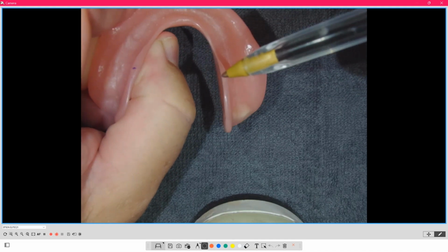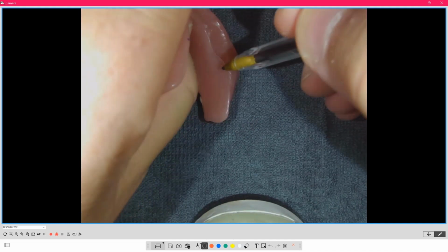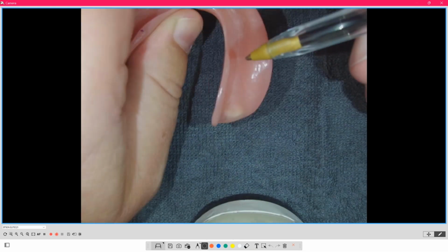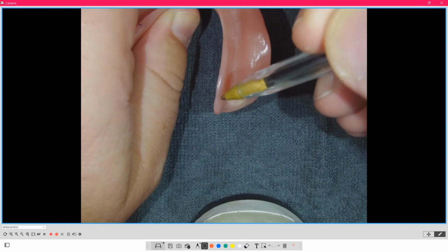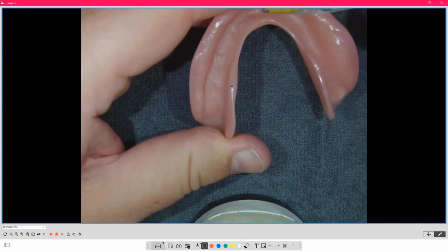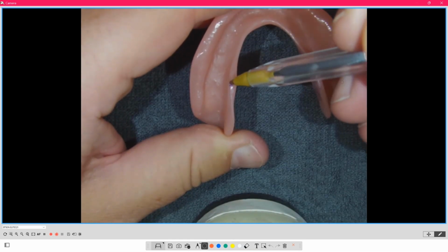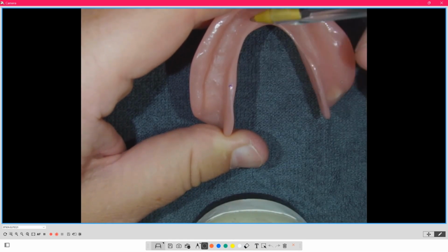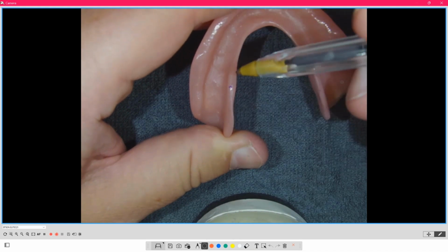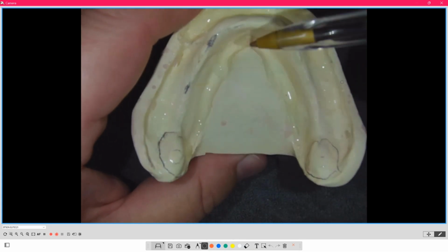So what you want to do is take this flange and scoop it out in here. Right in this area here, you'll trim it out, you'll feather it in, and that problem goes away. So again, typically what we see is it's just inadvertently too thick, and we didn't carve that S curve into the lingual of the denture. Like typically the S curve is here.